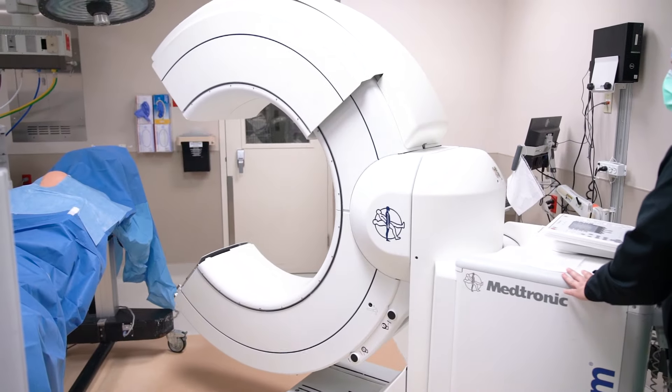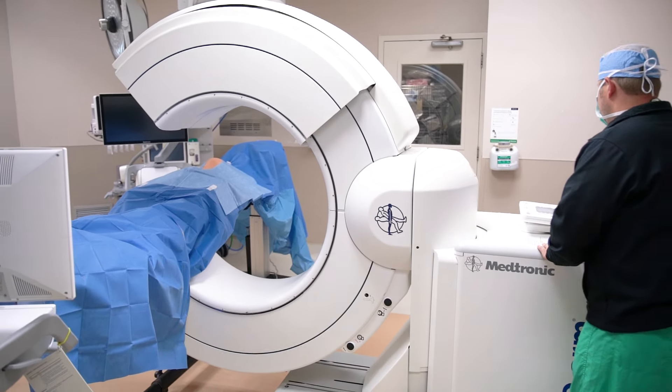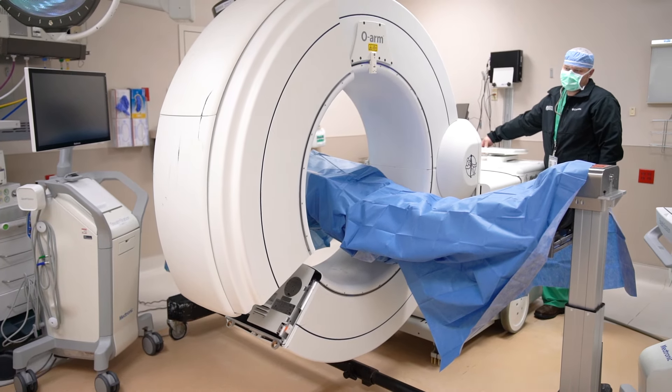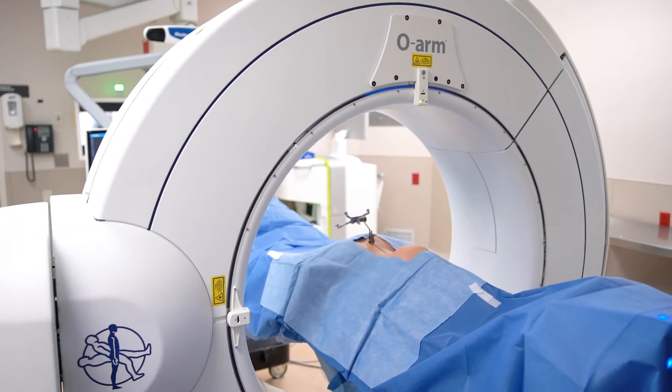The O-Arm is a technology that we're very fortunate to have here at North Mississippi Medical Center. In fact, it was the first hospital to adopt this technology in Mississippi five years ago. It is essentially an intraoperative CT scanner that helps us precisely implant instrumentation and do our job.